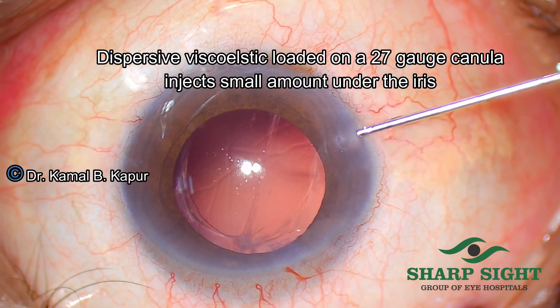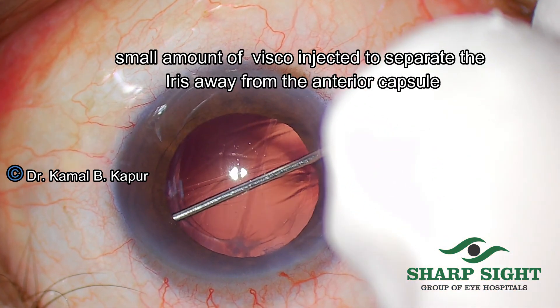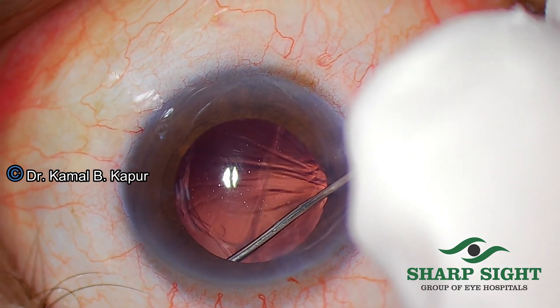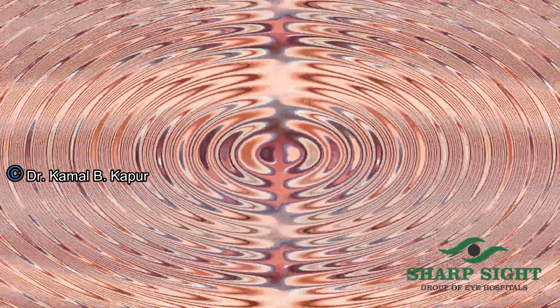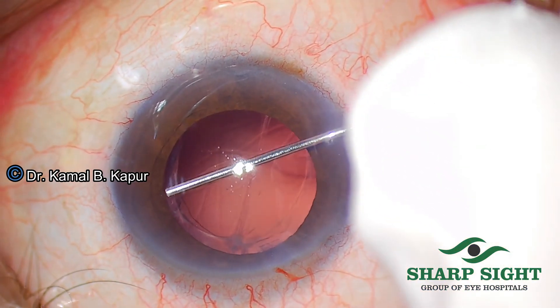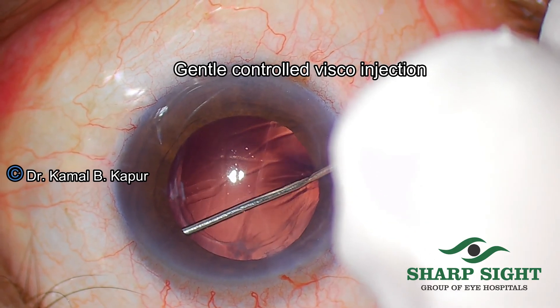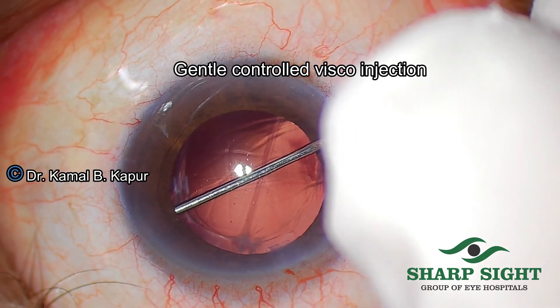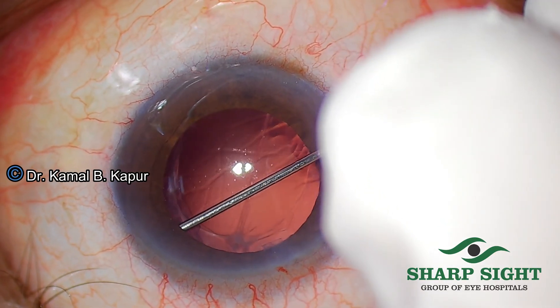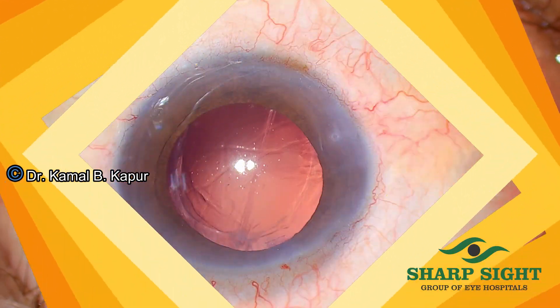We load a 27 gauge blunt cannula onto the viscoelastic and very slowly and gradually inject some viscoelastic just behind the iris to separate the iris and create a plane between the anterior capsule fornix margin and the posterior surface of the iris. We will see that again in slow motion. This injection of viscoelastic has to be as gentle as possible to make sure we don't have any viscoelastic getting into the vitreous because of the opening in the posterior capsule, as this may lead to delayed reactions in the vitreous.